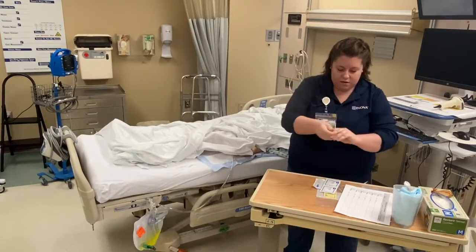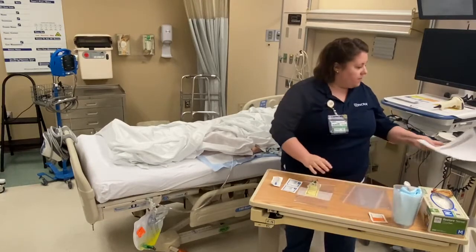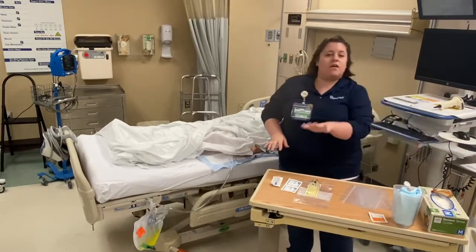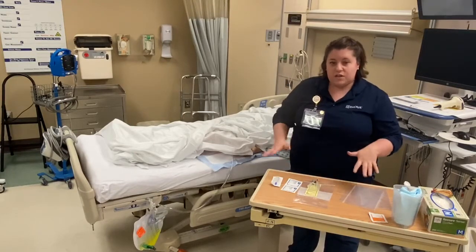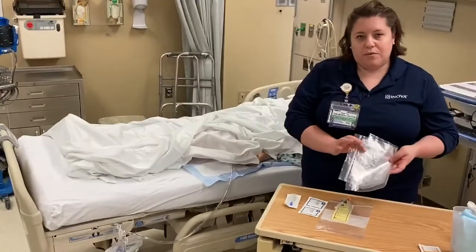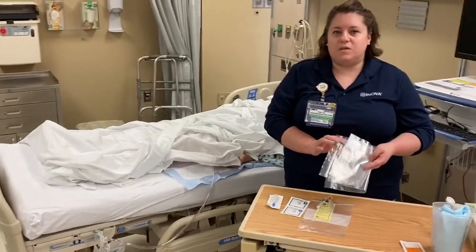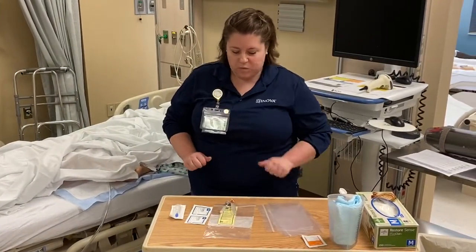So I have all of my things and I've set them on the bedside table. Before I set them on the bedside table, I make sure I clean the bedside table, I move any patient belongings so that my area is nice and clean. And actually, I did forget to mention, I bring in extra bags because when I send the sample to the lab, I'm going to double bag it. So I bring those in as well.